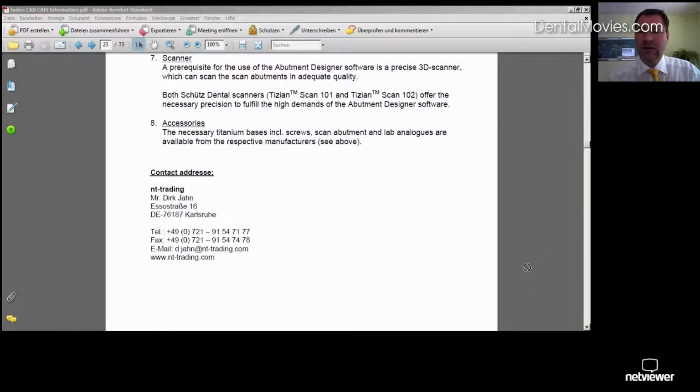Okay, I will not bother you with more details and will give the moderation over to my colleague Jochen Zagolla. We will just switch our screens, and now you will see his screen and also his video camera. The video camera is already adjusted to the scanner, and we will show you what all the steps are about.